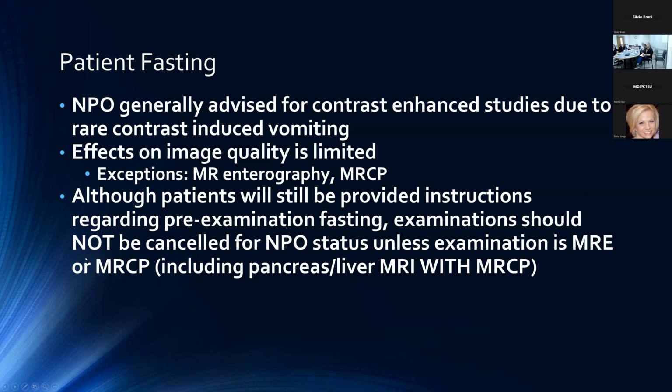With regards to the MRCP, any cases of pancreas or liver MRI that include the MRCP images would also fall under the scope of cases that should be canceled and rebooked for patient failing to be NPO. But for a routine pelvic case or routine liver, most other cases, I would say that we should be proceeding even if the patient has come in and had something small for breakfast or a coffee or something like that.